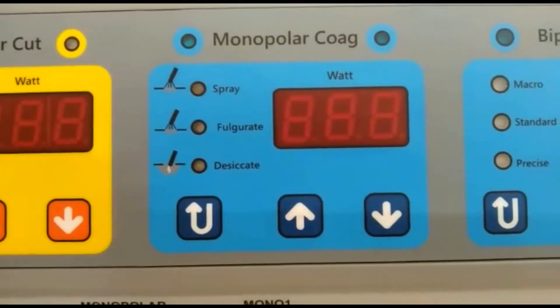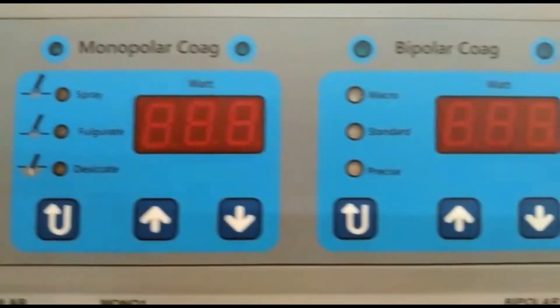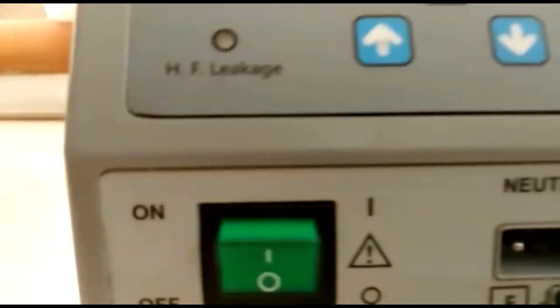In monopolar coagulation you have desiccate, fulgurate, and spray modes. You can change these modes or increase or decrease power. In bipolar coagulation you have precise, standard, and macro modes, and you can increase or decrease power using these buttons. Here you have the power button for switching on the main unit.